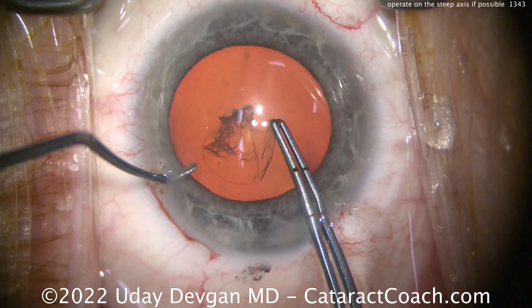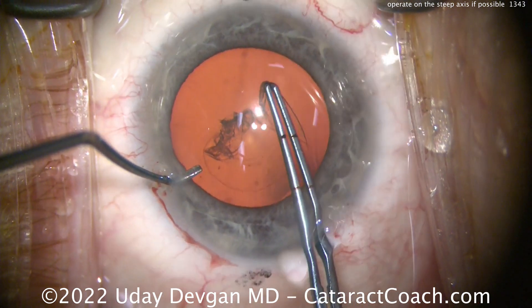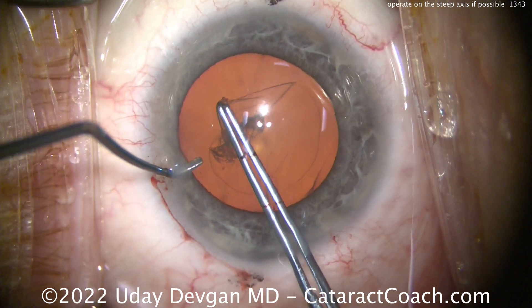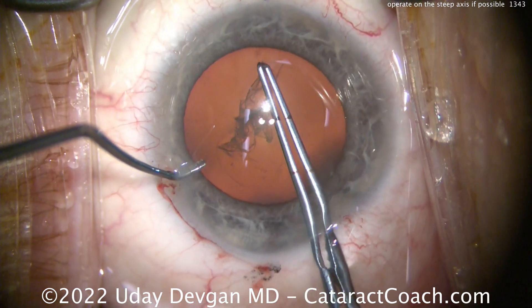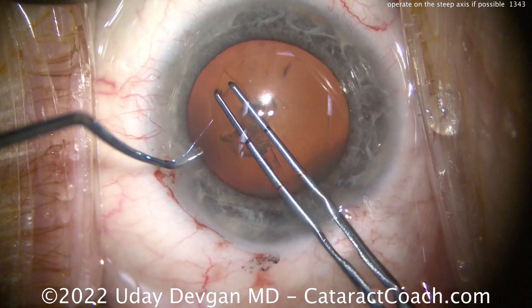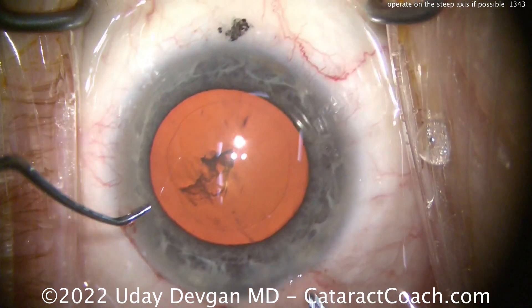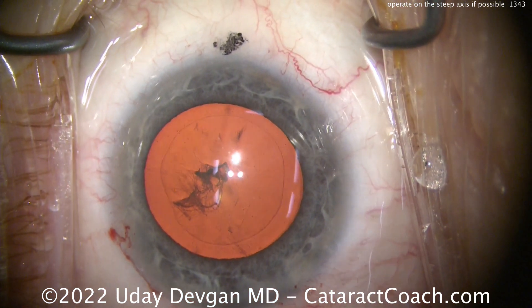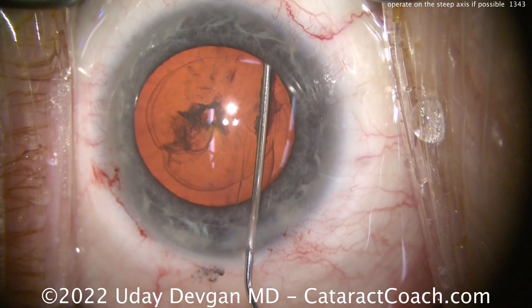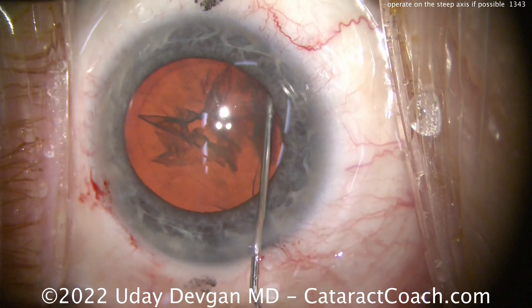I implore you — if this patient has a steep axis at about 180 degrees, why not benefit the patient by making the incision on that steep axis instead of giving yourself a few minutes of extra hand comfort during surgery? At the beginning of your learning curve, yes, I get it — you want everything lined up, you want to be as comfortable as possible, and you want to eliminate issues with your hand being in a less than ideal position.